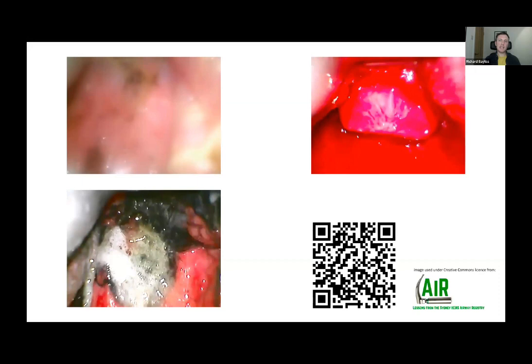You can mitigate against that with cautious use of the blade itself, and judicious use of suction to make sure that you don't end up getting anything on the camera. But that's much more difficult in a patient who is receiving chest compressions. In the bottom left, you can see an airway contaminated with soot after an inhalational injury. That can make it very challenging to identify the airway structures, and it can actually be more of a problem with videolaryngoscopy, where some of the devices have relatively less bright bulbs compared to most direct laryngoscopes.